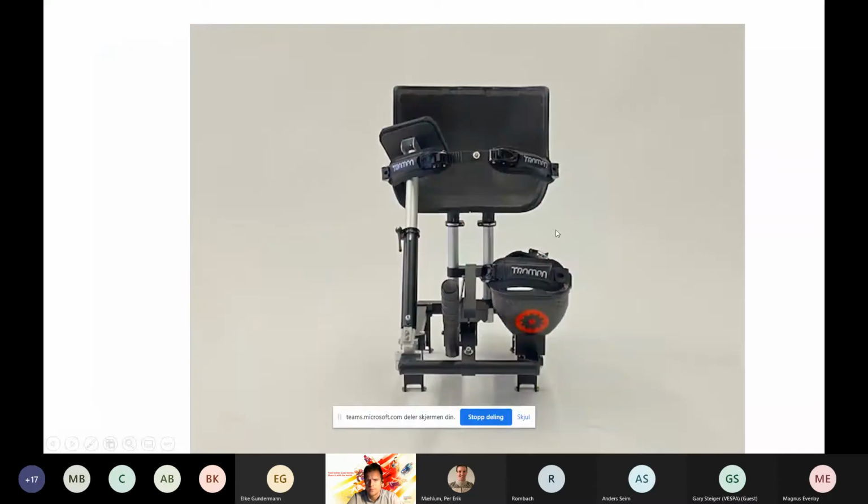Here's another option. We have had quite many athletes who are amputees where the whole leg is gone, and then we add a support that supports around the hip, instead of making a custom seat to support the athlete. We just have a support that directs the forces down to the frame, as on the other side where the leg is normal. And in that way we get the same balance. We stop the rotating in the seat.